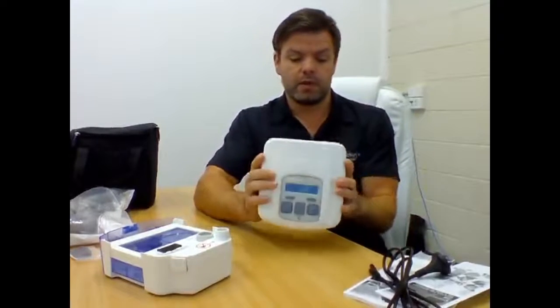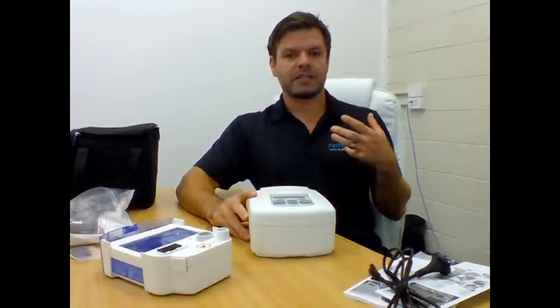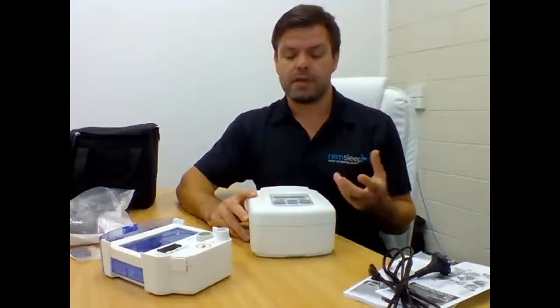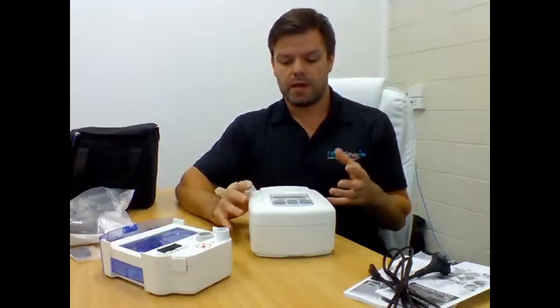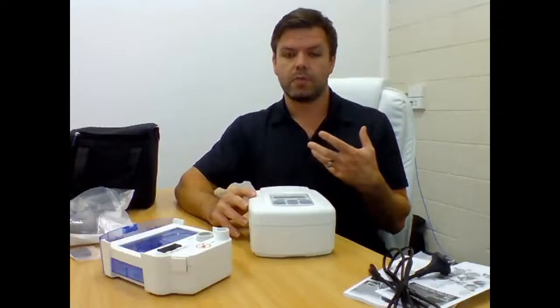And now our tubing can go in this hole, and we can run it just with the machine itself as well. So humidification is there to add moisture to the air, and that aids in relieving dryness, so dry throat and dry mouth sort of things. It doesn't really enhance the therapy, so to speak. The therapy is the actual pressure itself. It just makes it a little bit more comfortable.